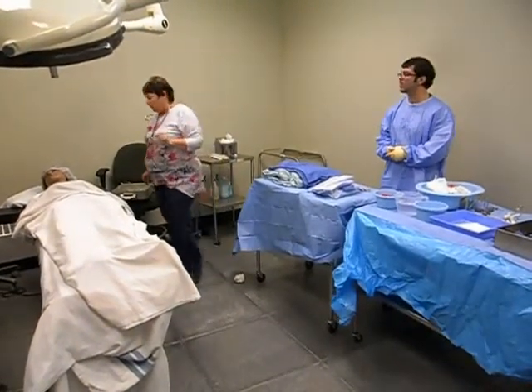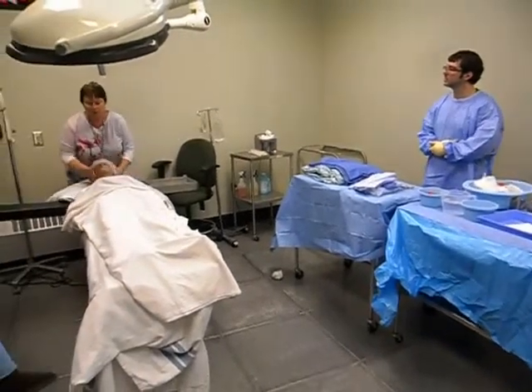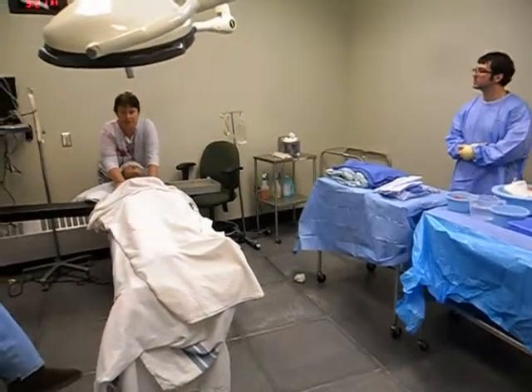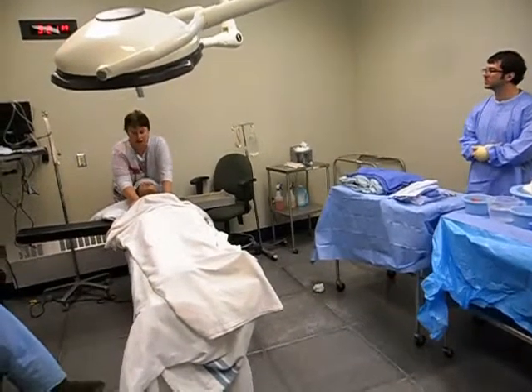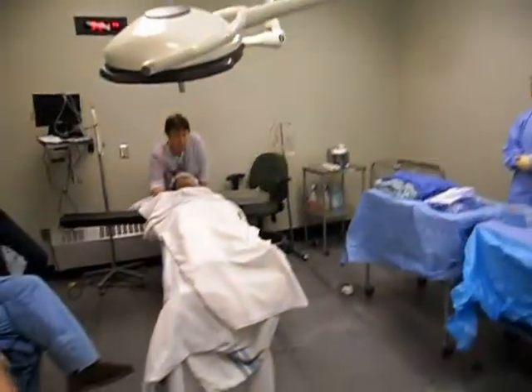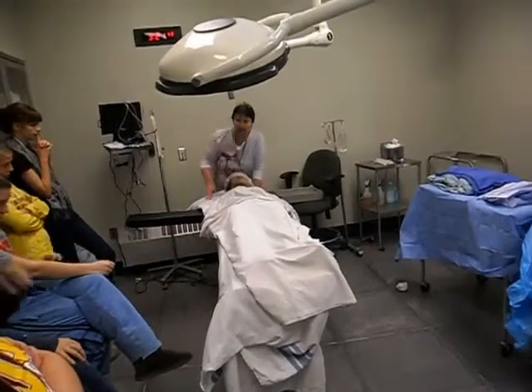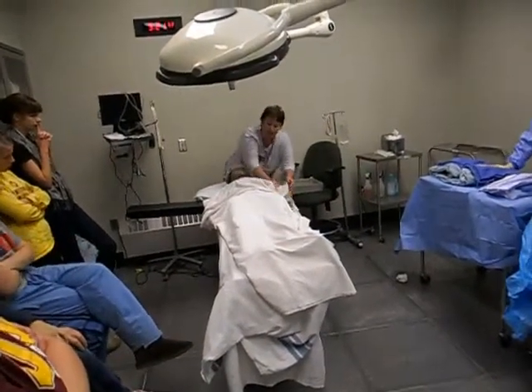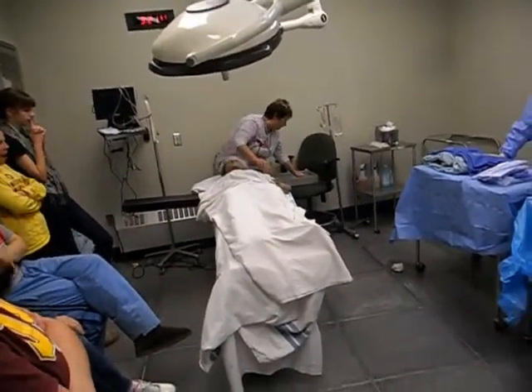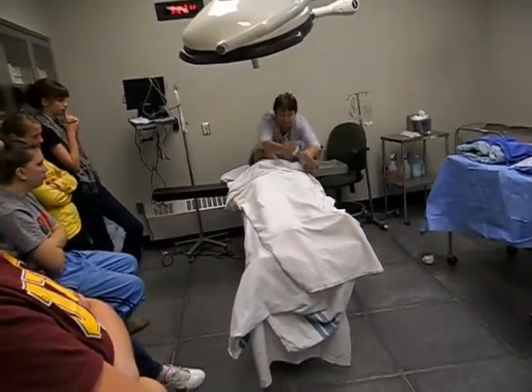Now we know she's going to be supine, right? And so right now anesthesia is going to do what? This is pre-induction. Right before we induce her, what is anesthesia doing? Putting on vital signs. Okay, so they're going to be putting the EKG pads on. So Mrs. Hanson, I've got some cold pads that are going to monitor your heart. You're going to feel me sticking them on your chest and your side. Mrs. Hanson, I have a blood pressure cuff I'm going to put on you. Okay? And then they're going to put the oxygen saturation on her finger.